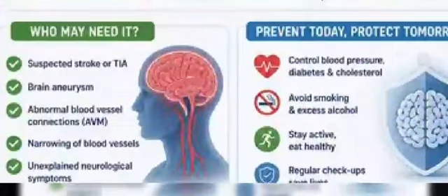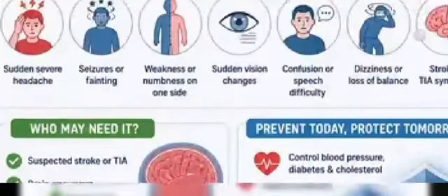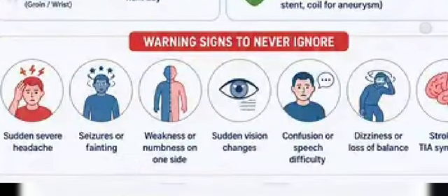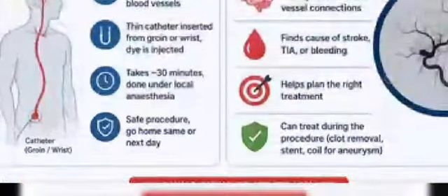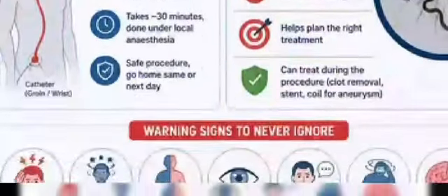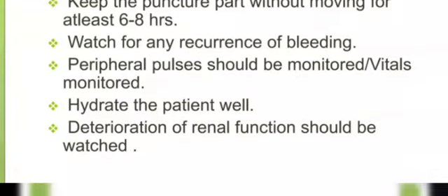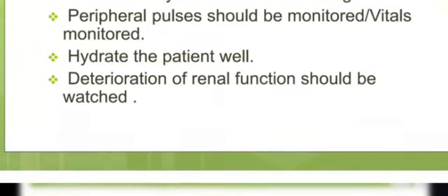Here some complications may occur. What are the complications? The complications are bleeding, stroke, or sometimes allergic reactions to the contrast administration. So it is necessary to take care of the patient during cerebral angiography.